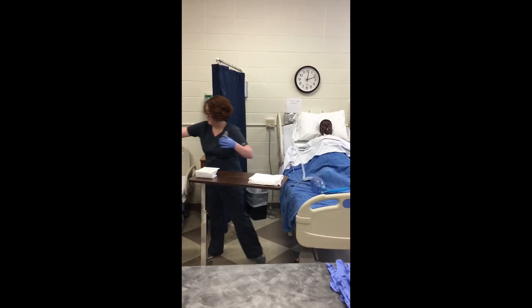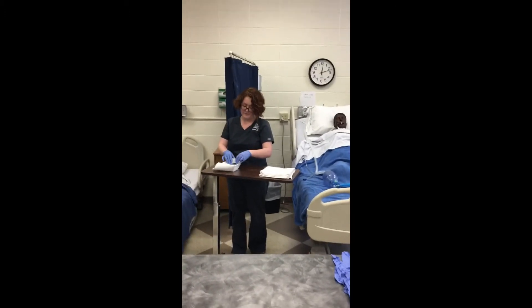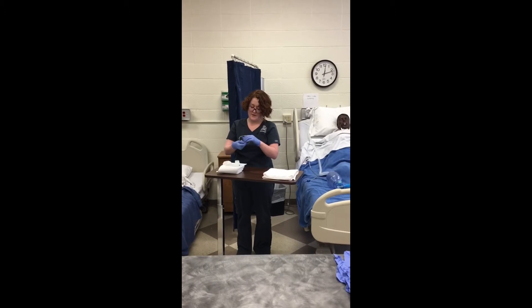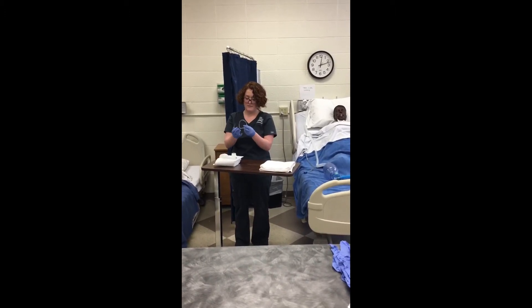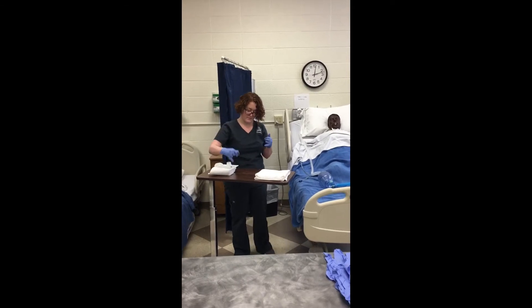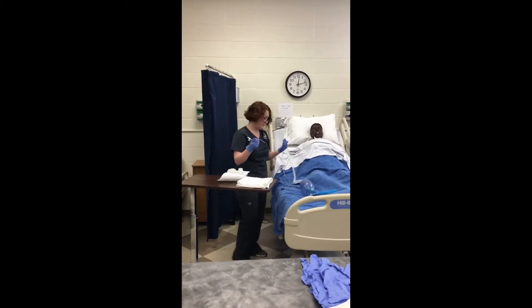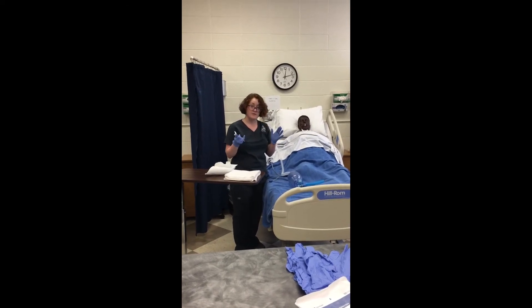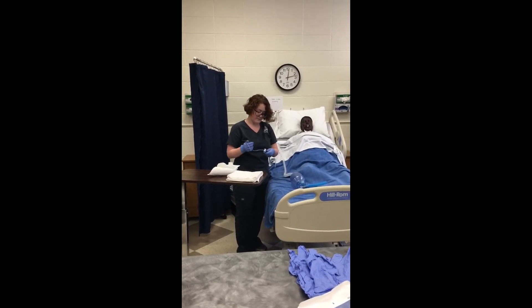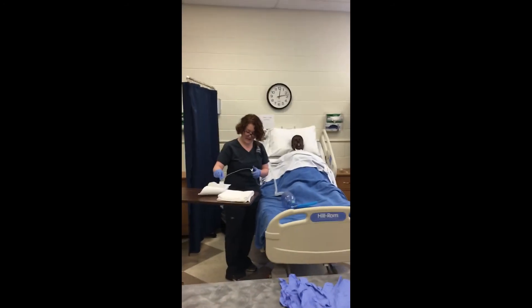I'm going to remove the packaging out of the way, then set up my sterile field: open my lubricant and get my catheter out. I'm going to gather the tubing in my dominant hand and bring it a bit closer to me, making sure I'm still touching the inside of the sterile field. Now I'm going to break sterile field with my left hand to apply the catheter.